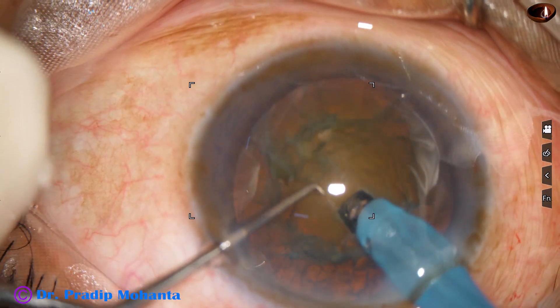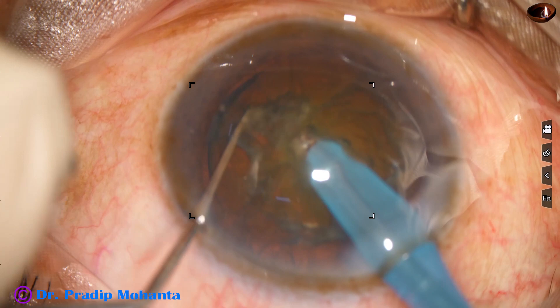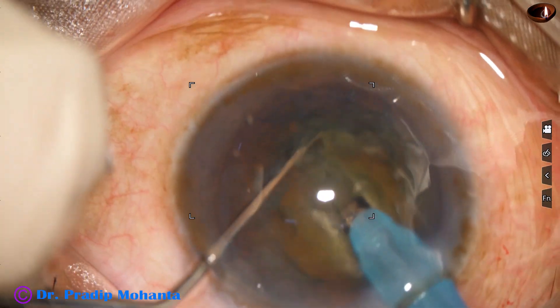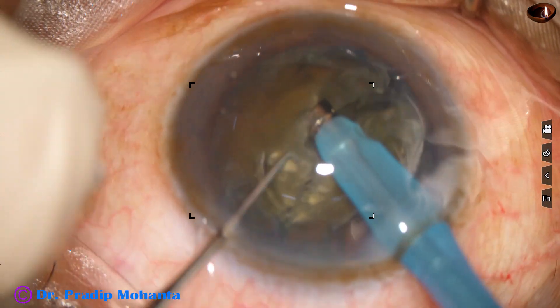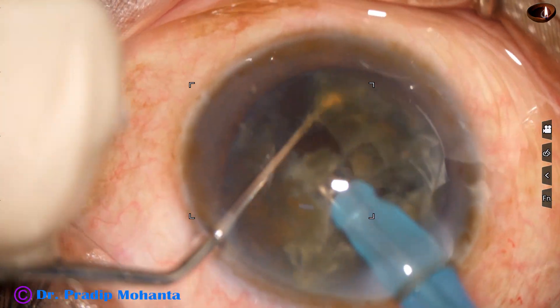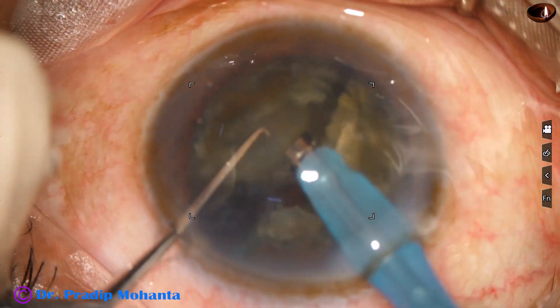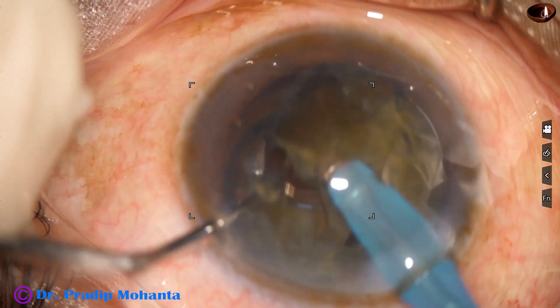The nucleus is pushed a little down and the tip is buried into the substance of the nucleus. The nucleus is then chopped. I have divided the nucleus into two heminuclei. Each heminucleus is subdivided into two larger fragments, so we have got four pieces.